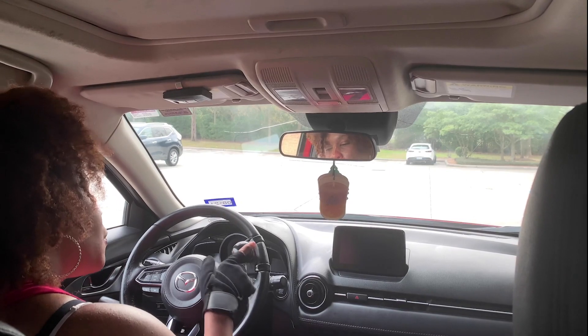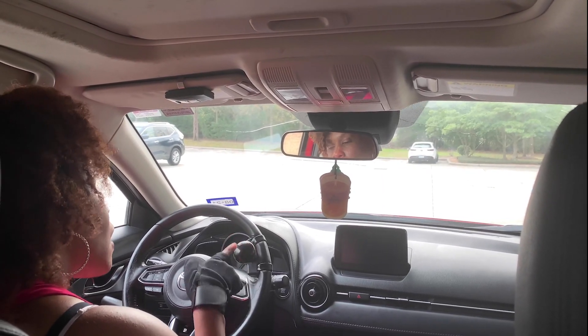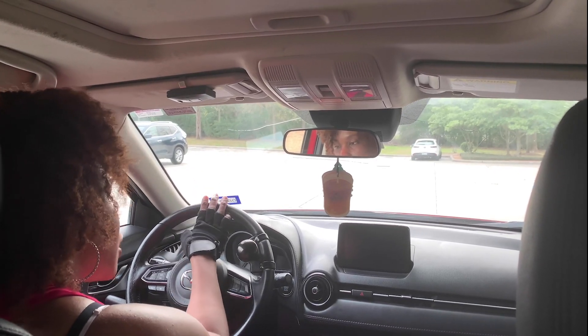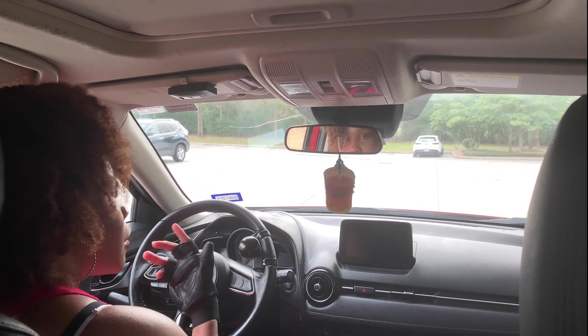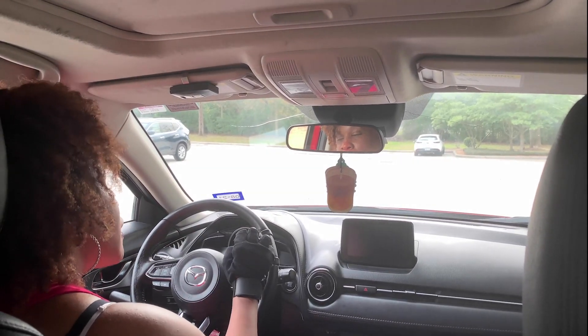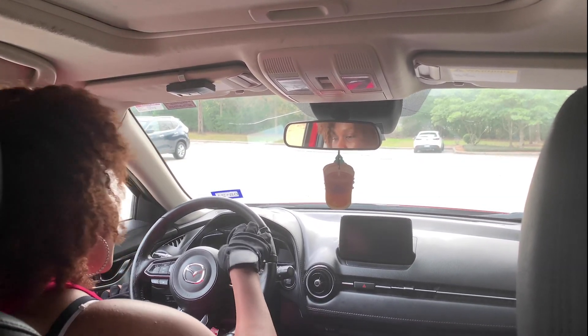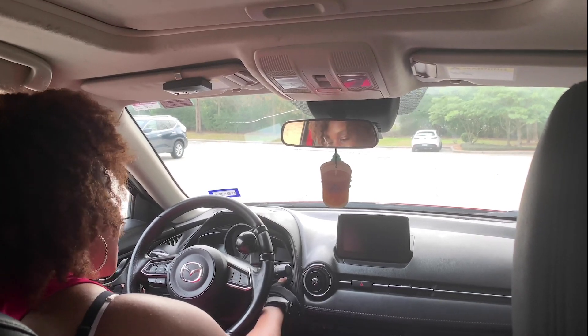Let me explain what this little thing here is — it's called a steering knob. With me being a quadriplegic, I have a little bit of trouble with the muscles in my hands. So this just gives me a better grip on the steering wheel when I'm turning. With that being said, let's go.